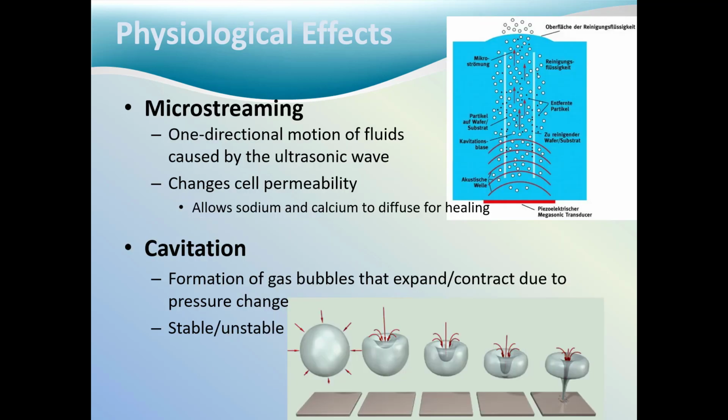Microstreaming occurs when eddies form. The ultrasonic energy causes the acoustical streaming or microstreaming. Acoustical streaming is the bulk of fluid flow in one direction. When the acoustical stream courses around gas bubbles, the cell membranes, and its organelles, then eddies form. The eddy currents over the cellular membranes cause the release of free-floating ions and small molecules, increasing the cell membrane permeability that alters the diffusion rate across the cell membrane. This change allows sodium and calcium to diffuse for healing.